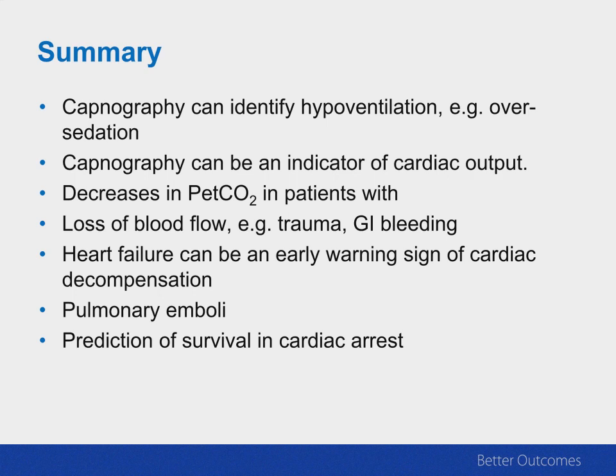Now, the other thing, which is really what's fascinating about a capnogram, is it can be an indicator of cardiac output. So if I have a patient, and let's say I'm on a rapid response team, and I'm called to see the patient, and I put a capnogram on and the reading is low, well, it could be one of two things happening. The person might be over-breathing, and so a blood gas would be necessary to tell us that. But it also could be indicating they're in heart failure. They could have lost blood. The idea being is that the capnogram will warn us before anything else what's going on in terms of blood flow. Now, it could also be a pulmonary embolism.